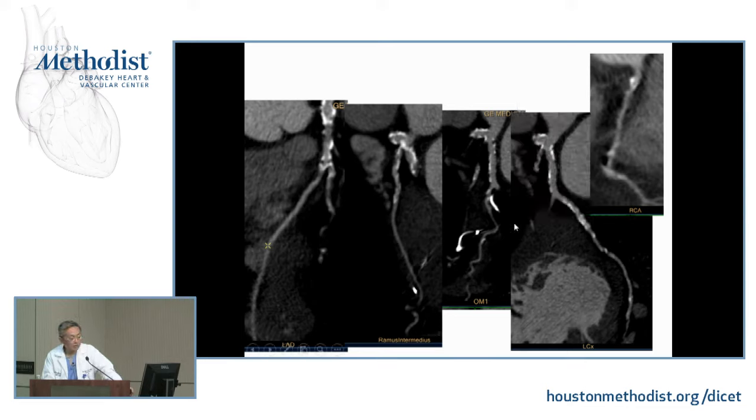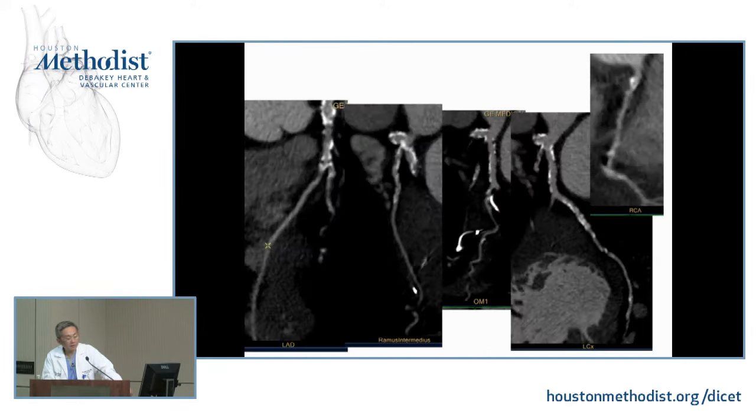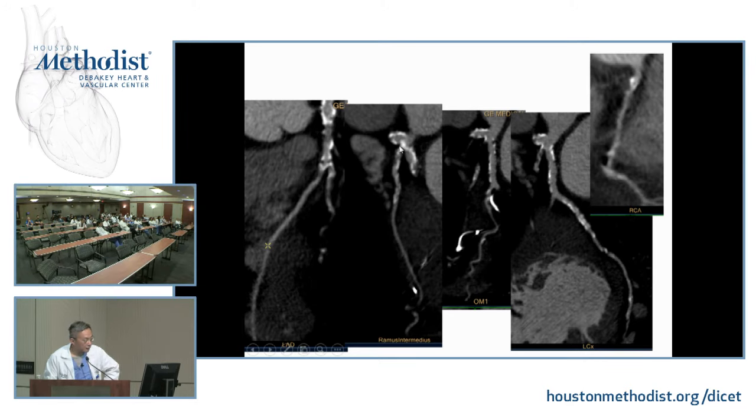Is it true or not? So we sent it for CT-FFR. And the vessel that showed up, can you go back? The second from the left, the hypoattenuated areas in between. How can you say that there's no thrombus, no soft plaque? You know, the patient is stable, an outpatient.